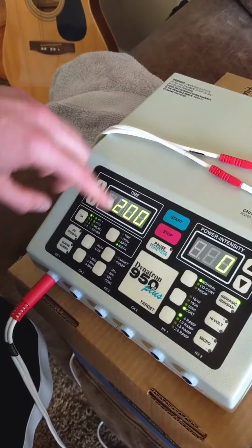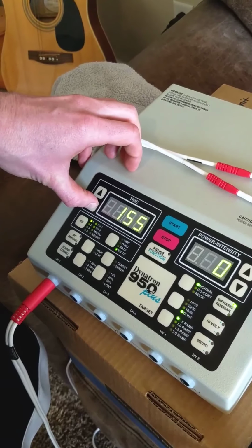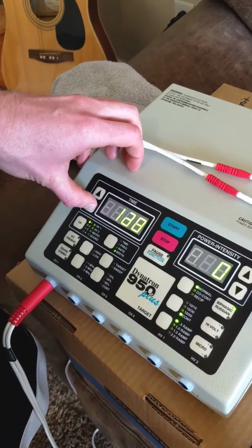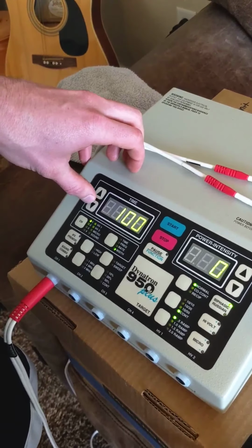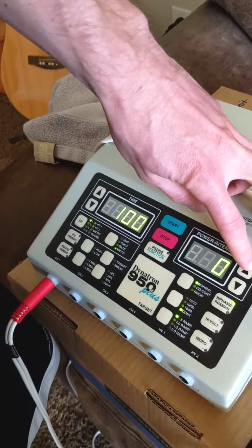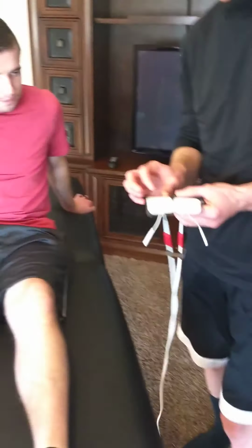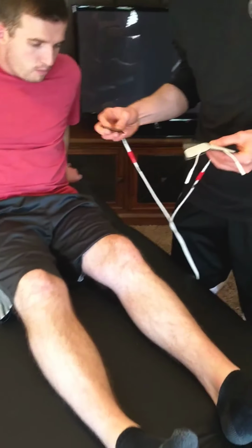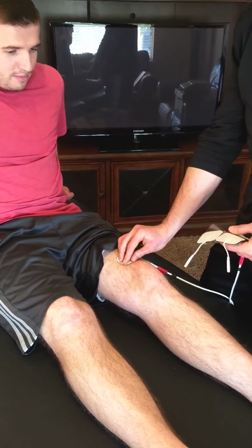So we're going to go with 100, and then our width or our duration for this application is actually going to be 100 microseconds. So I'll bring that down, and we're on channel 1. The intensity is going to be just whatever feels comfortable for Hank. So I'm going to take these pads now, and Hank, as I put these on, I'm just going to put them on either side of your knee here. It may feel a little cold, so just be aware of that.